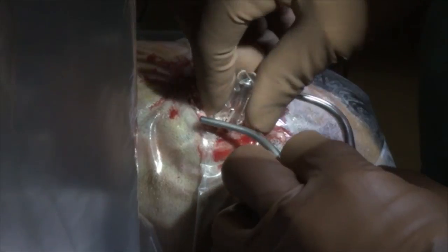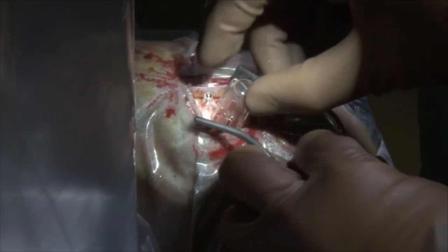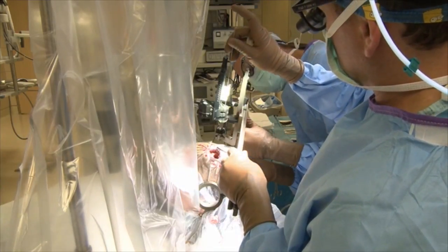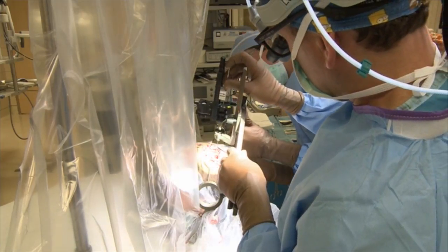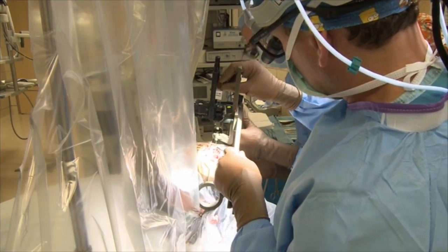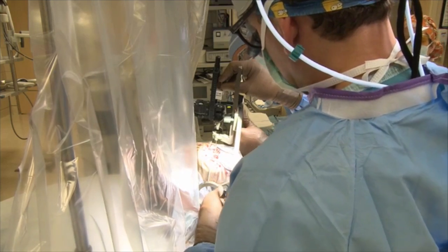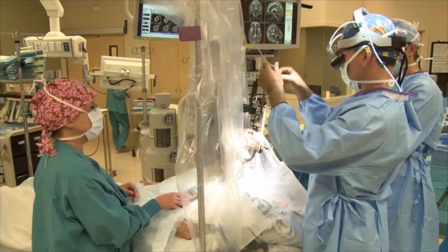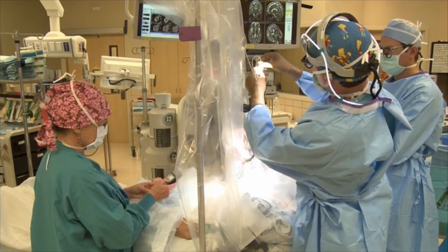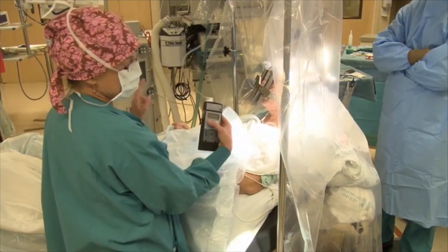This is called the Stimlock cap — it basically locks the electrode into place once we have it precisely located within the brain. This is the Lexel arc with a micro driver attached — that black thing just beneath my hand. I'm placing the cannula down to ensure it goes precisely through the hole we've created and through the exact part of the brain I want to enter with the electrode. We've placed the electrode already into the VIM target and are now connecting the cable that goes from the sterile part of the field to the non-sterile part, over to Diana's controller, and she's starting to turn on the stimulation.